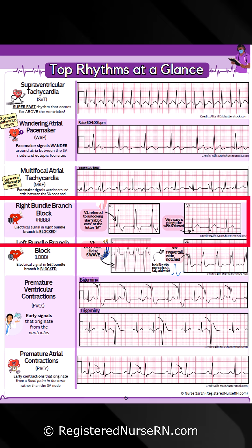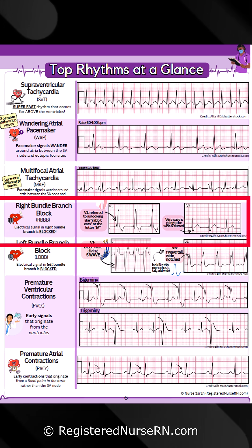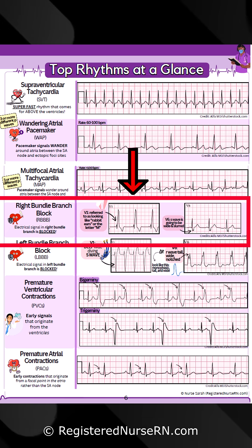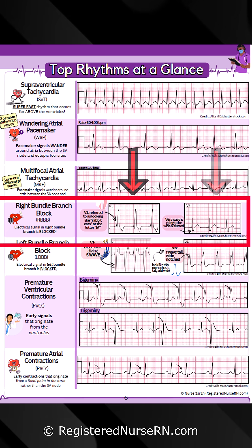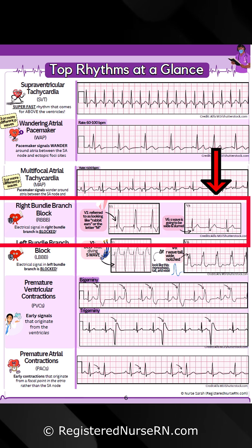Right bundle branch block is where electrical signals in the right bundle branch are blocked. Pay attention to V1 — it's sometimes referred to as looking like rabbit ears, or the letter M, like in this example. And look at V6, where the S wave is going to be wide and slurred.